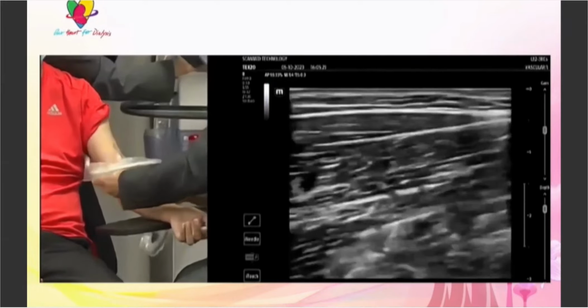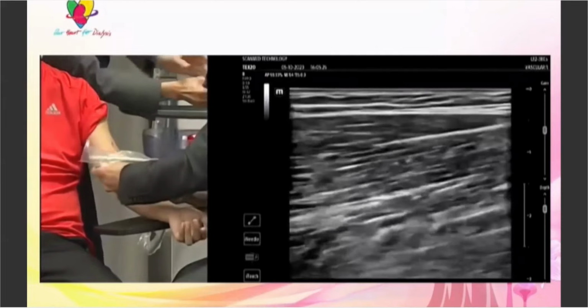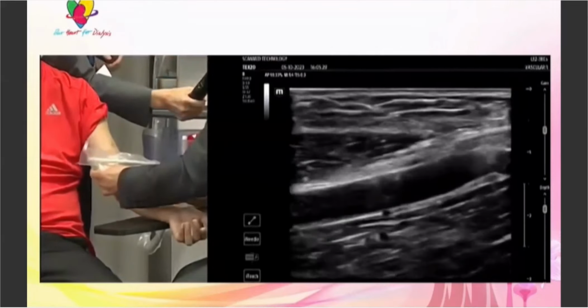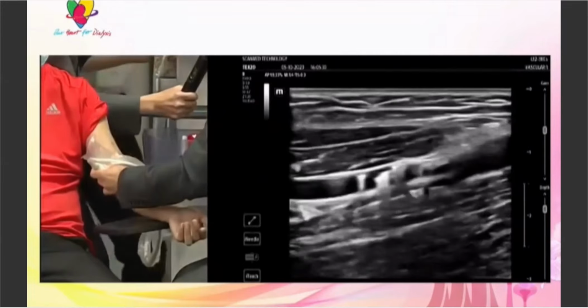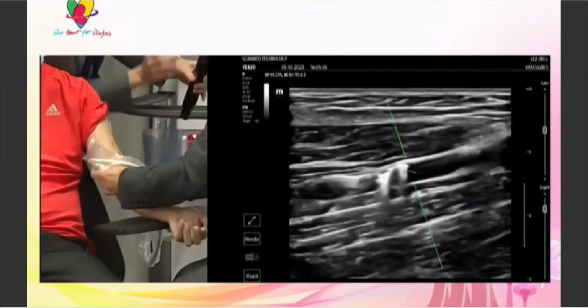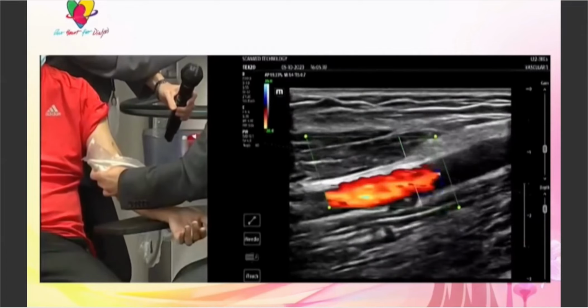So the first thing I would do in this patient, after I failed the thrill and did augmentation, etc., I would measure the flow. And accidentally, I realized that there is a coil in the brachial vein, which was placed either during the creation or during the secondary intervention.